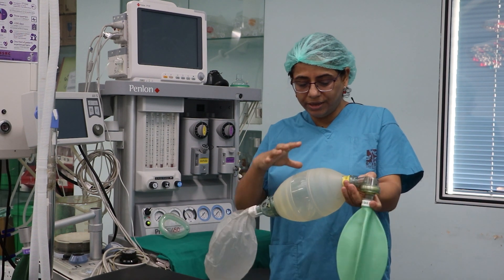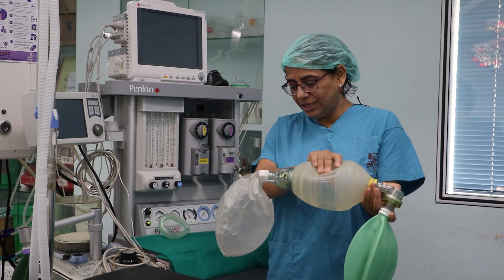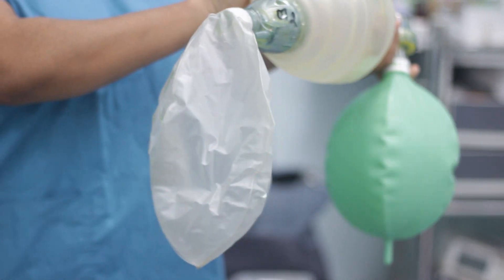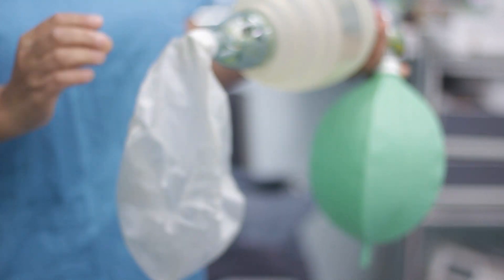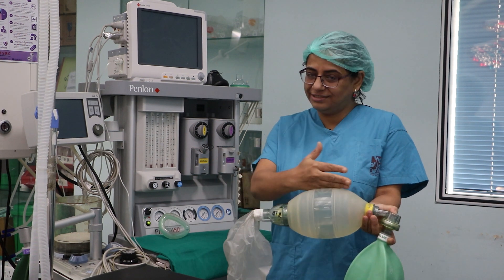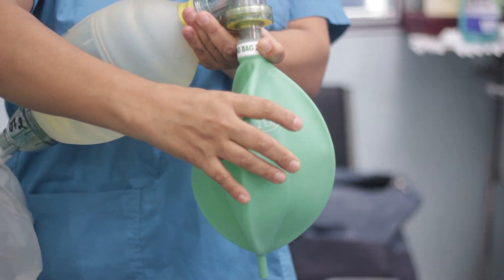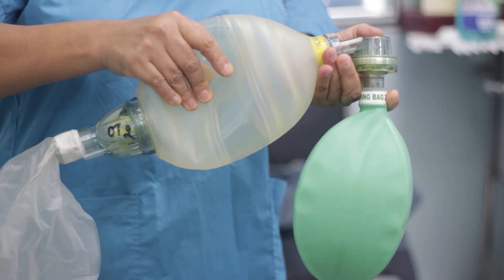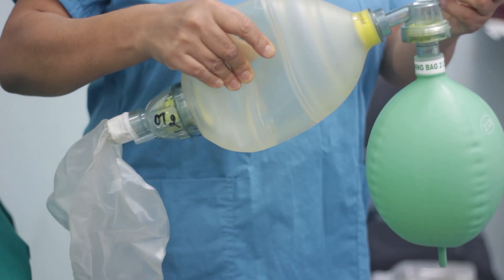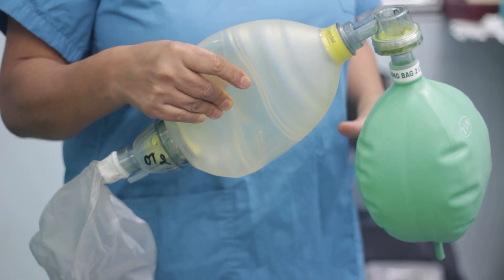Now when I squeeze it, please look at the reservoir bag carefully. When I squeeze it, this reservoir bag is getting deflated. That means the air in the reservoir bag is getting sucked into the bag. And this was getting inflated — so the inspiratory valve is also functioning.